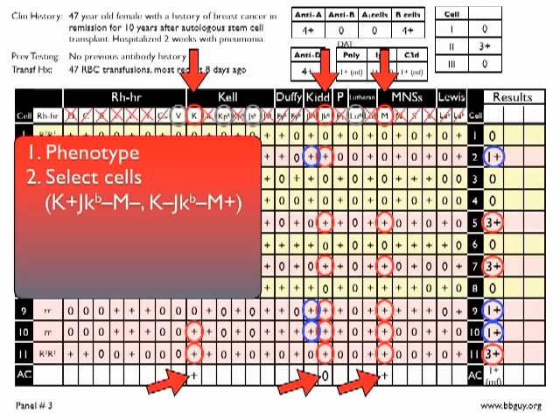So you would also need to do some additional rule outs of some of those antibodies that I mentioned, such as big C, where you only have one homozygous or double dose rule out, Duffy A, Duffy B, big S, things like that. So all those are things that you could do. I don't mention it here. You could also do some work with enzymes, and we'll talk about enzymes on the next panel. I'm trying to keep it as simple as possible for this one.